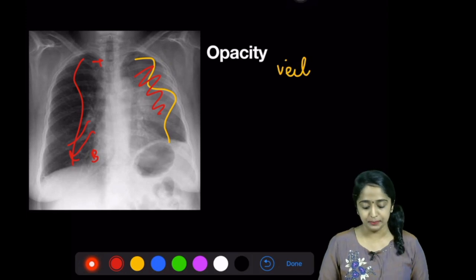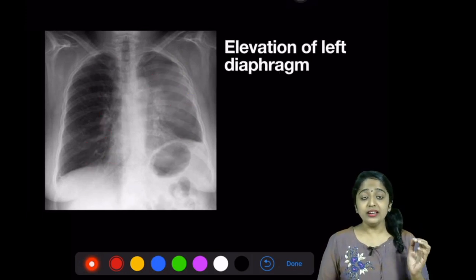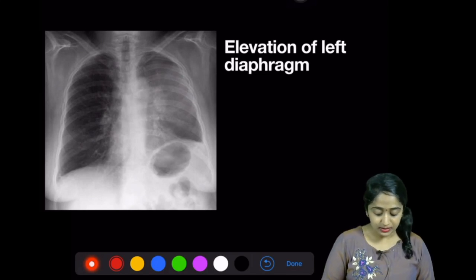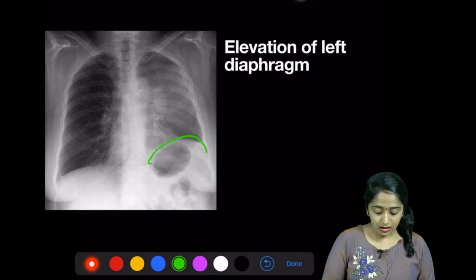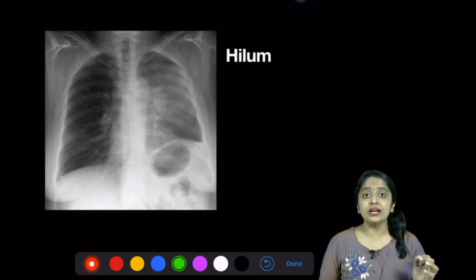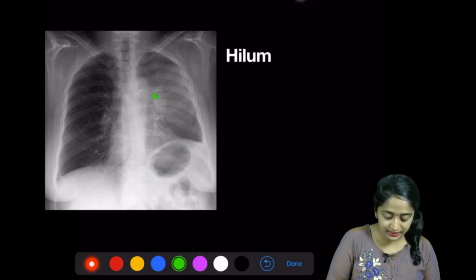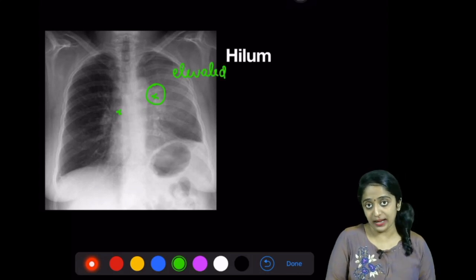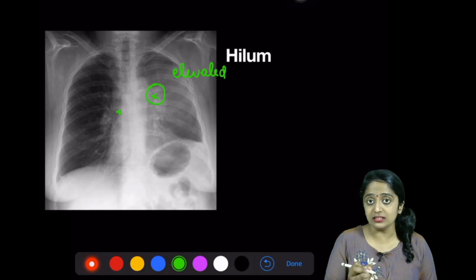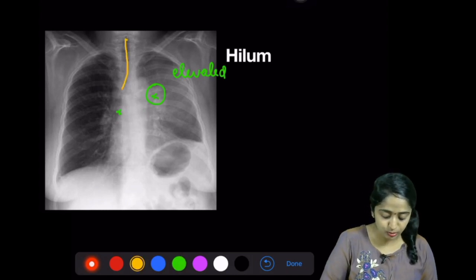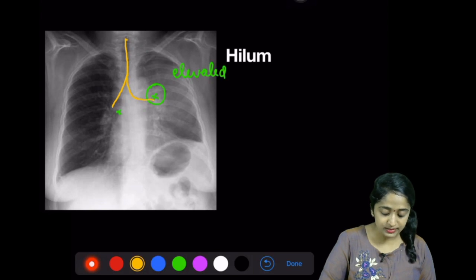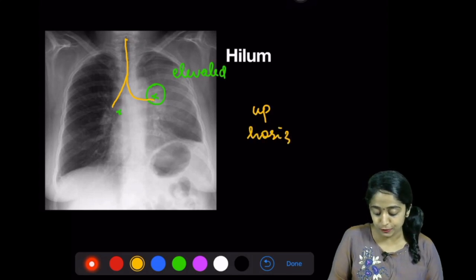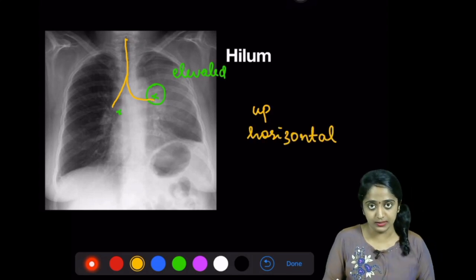Now let's try to spot all the associated abnormalities to characterize this opacity. The next striking abnormality is looking at the diaphragm — you can make out that the diaphragm is elevated. Then, looking at the hilum, you can see that the left hilum is elevated more than expected. Looking closely at the left main bronchus — tracing from the trachea, this is the right bronchus — the left bronchus can be seen to be pushed up and it is more horizontal.